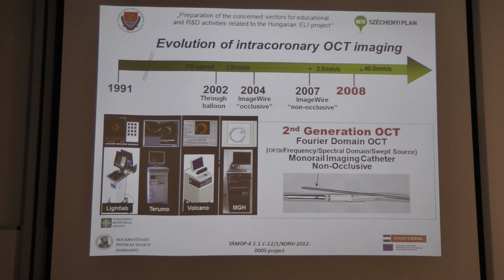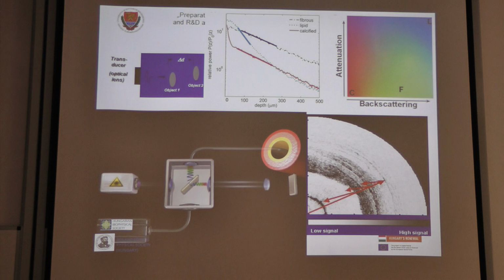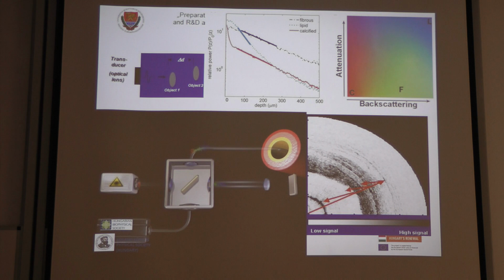It's only, let's say, 30 or 40 cases per year, but in clinical studies where different kinds of pharmacological interventions are intended to decrease this plaque growth, as many as 100 or maybe sometimes 200 patients will be examined for a clinical study, where the pharmacology big company provides the catheter free of charge, of course.